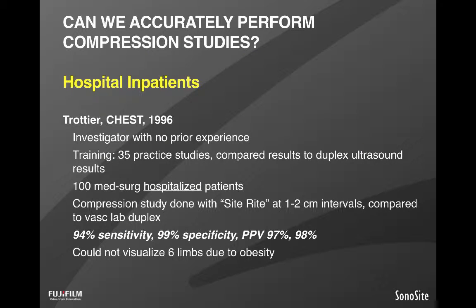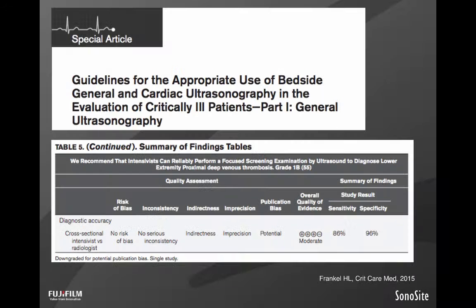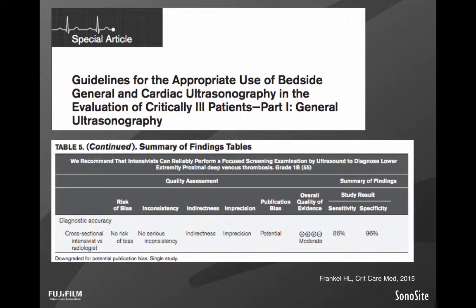This is one on hospital inpatients. Again, I can go through a number of these studies, really just to support all of you out there who are asking yourselves whether you can do it, whether you should do it. I'll tell you again, in the number of times that it's been looked at, not only emergency medicine, in the hospital, but here, a study that I did in the ICU, we showed that we could all be quite accurate. In fact, equal accuracy. Again, in this study, we had one false positive, as well as a number of true positives that were missed by our colleagues, but that we found. And so the accuracy was overall equal here.